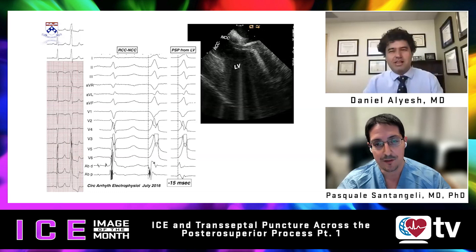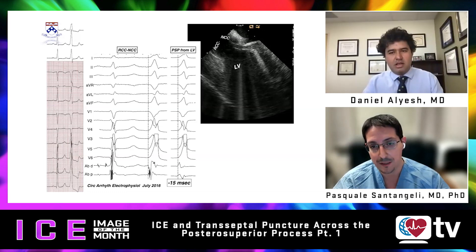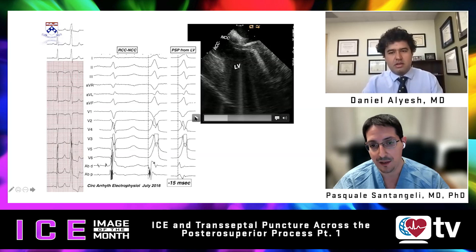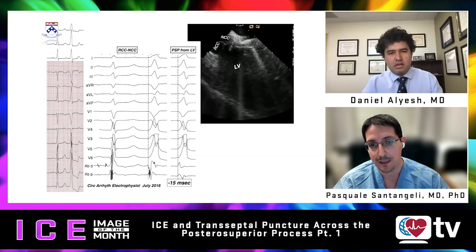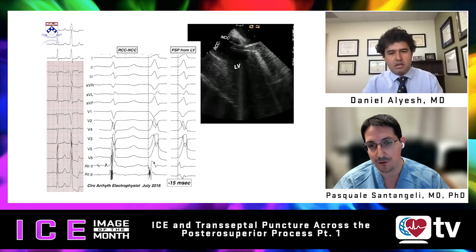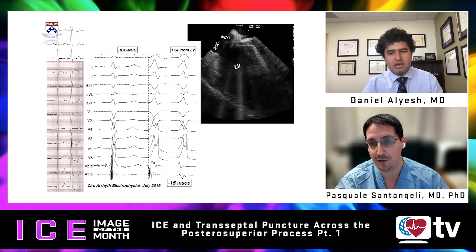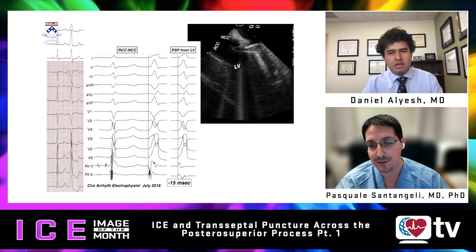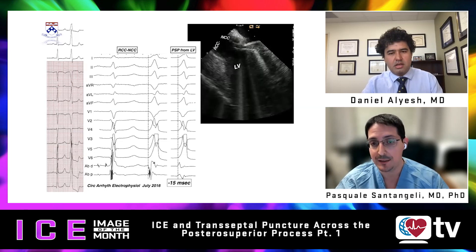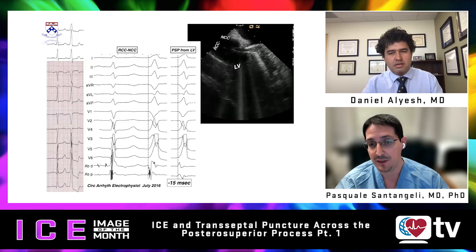In this case, on the left side of the image there is a sinus beat and a PVC beat. The PVC shows a left bundle branch block morphology with very early transition, inferior axis, fairly positive in lead II, and predominantly positive in lead III — consistent with a para-Hisian-type exit on the left side of the septum.